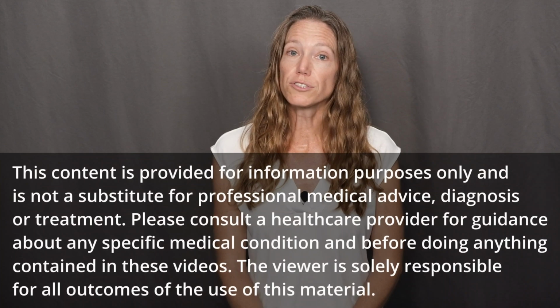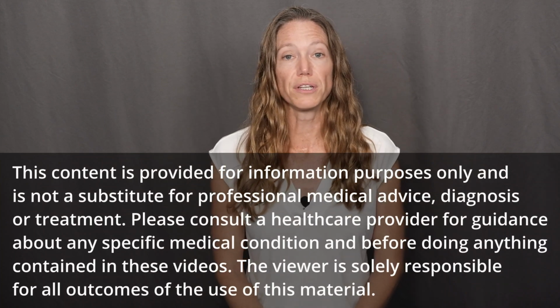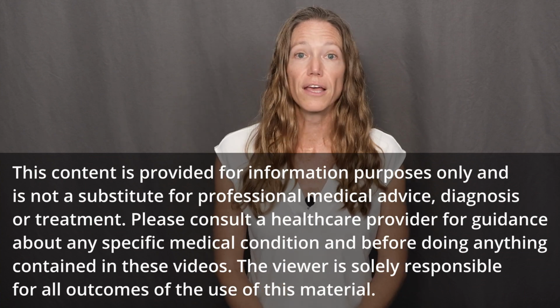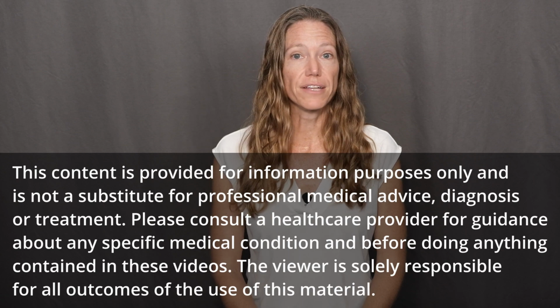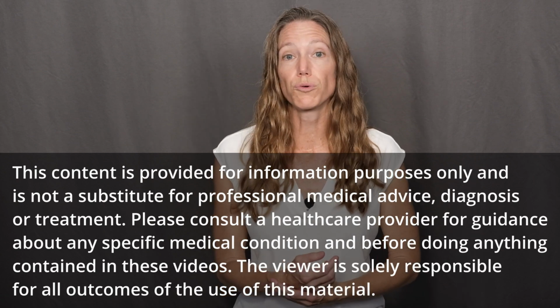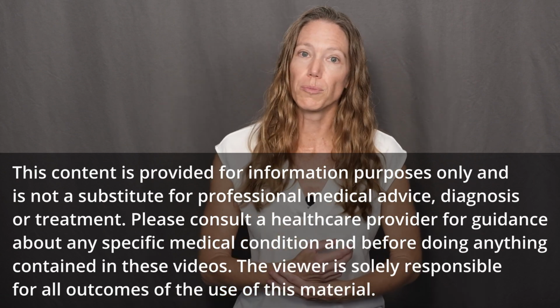Today's video is all about wrist braces. So I'll share with you a little bit about what braces do, when to wear them and when not to wear them, and I'll show you an example of 3 different types of wrist braces. I'll also include some helpful tips for choosing the best brace for your needs and how to take care of it. Okay, first of all, a brace provides external support for a joint or joints in a particular body part.